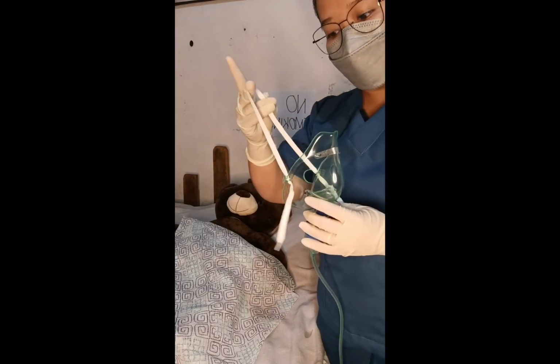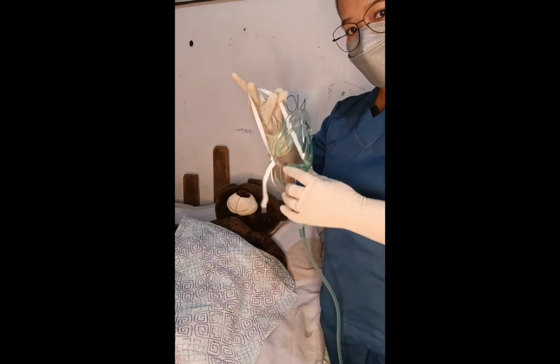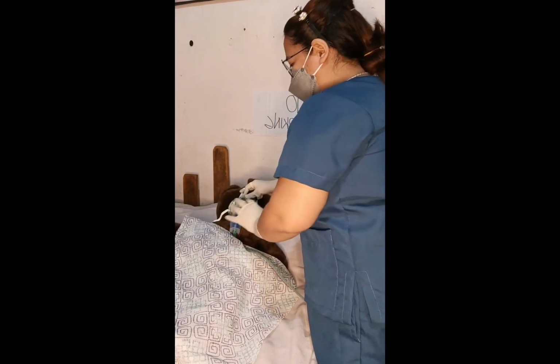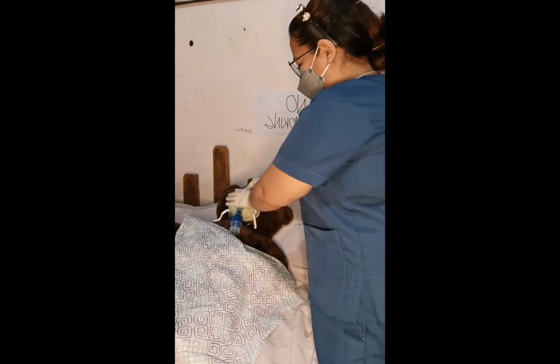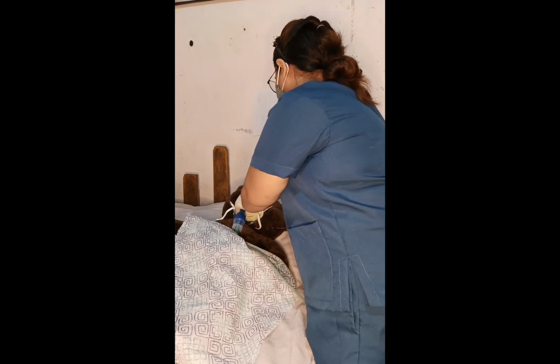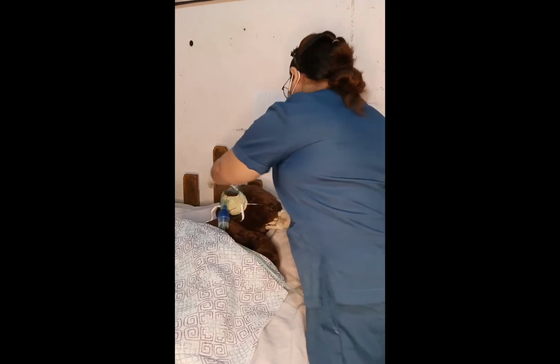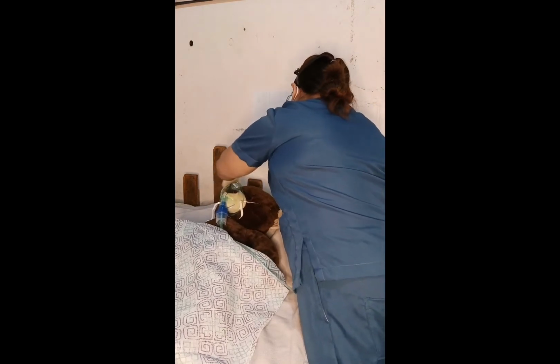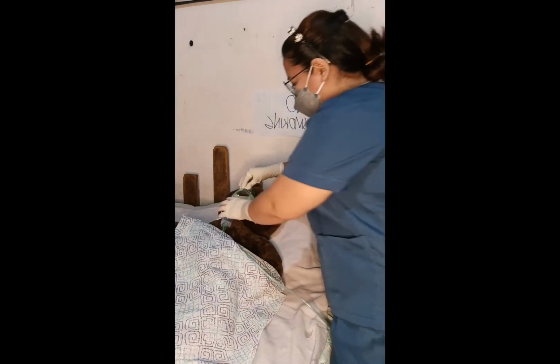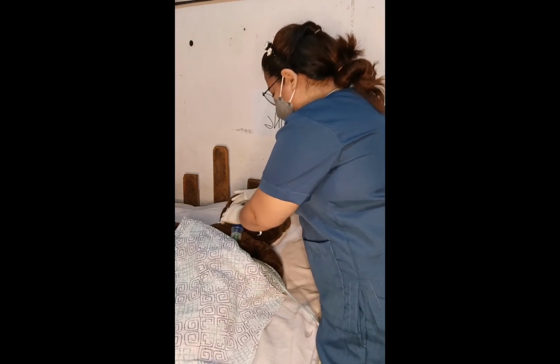This garter is used to adjust the mask on our patient's face. So once it has already been placed properly, we'll put the garter around the head. And let's make sure that our patient is comfortable. We will adjust the metal rim over the nose and contour the mask to the face.